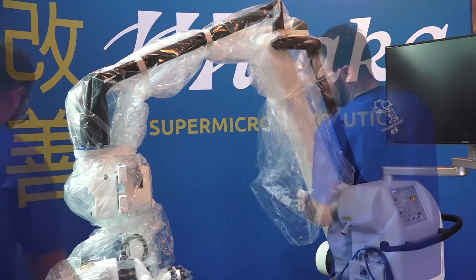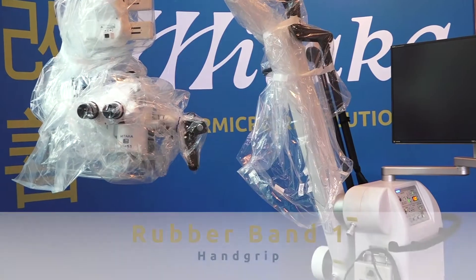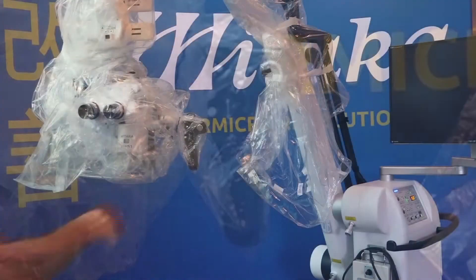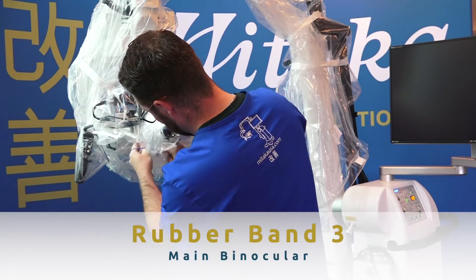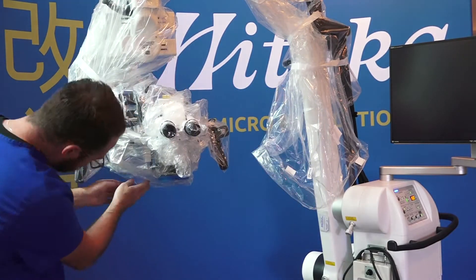It is now time to place the rubber bands. Start with the hand grips. After securing both hand grips with doubled-over rubber bands, move on to the eyepieces. Once the main eyepiece has been affixed with the rubber band, take all the extra plastic that is underneath near the front lens and pull it up into the rubber band.